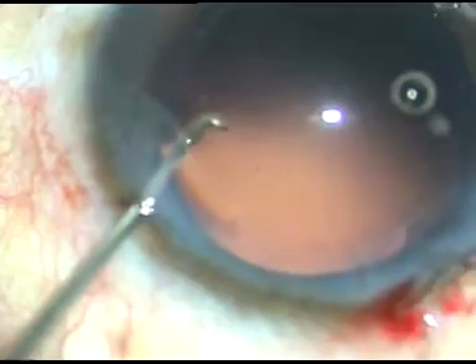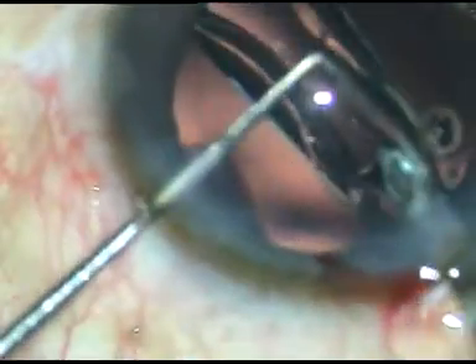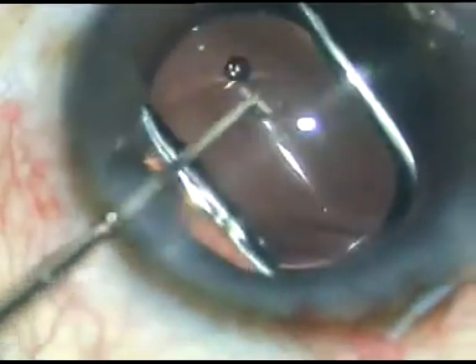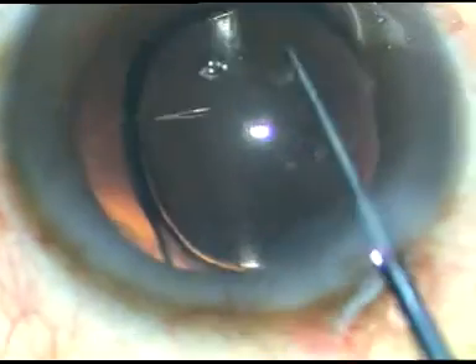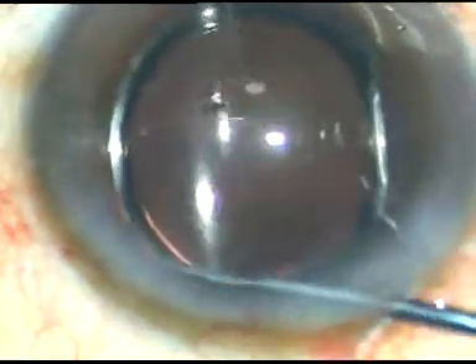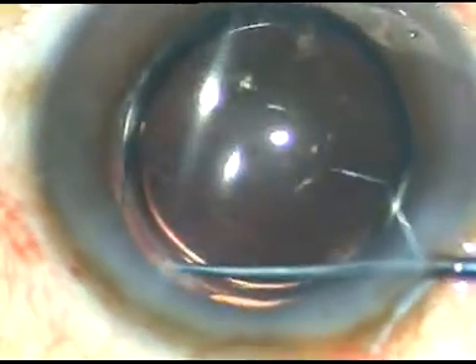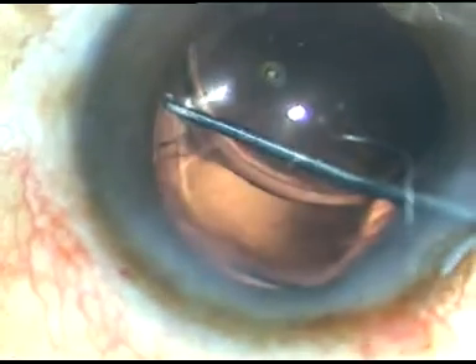In this case, this is a hydrophobic acrylic intraocular lens from Bausch and Lomb — it is the NVista. It is a glistening-free intraocular lens. I have a follow-up of about four years and have not seen any glistening till now.